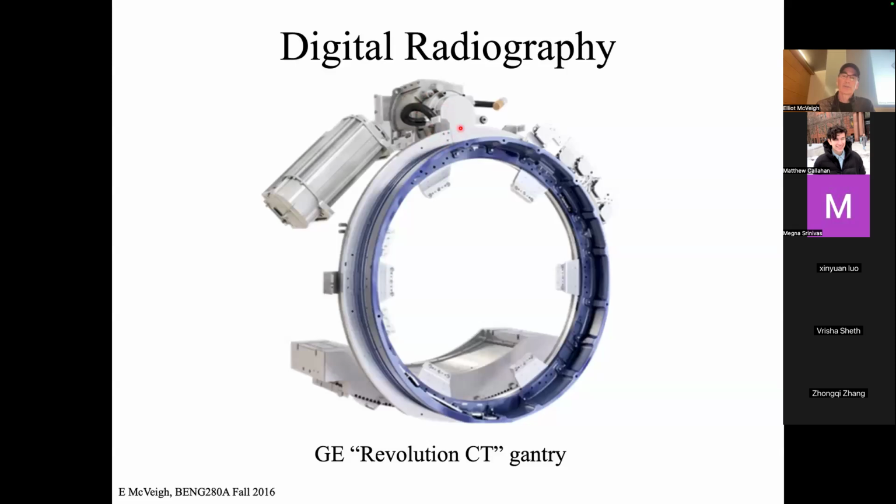The X-ray tube is with a fixed orientation to that grid. The two of those things, the X-ray tube and the detector grid, rotate synchronously. They're on the same gantry. They're attached to the same piece of hardware. It's a big ring, and that ring spins around the patient. And the modern scanners, the ring spins 4 times a second. So 4 complete revolutions a second.